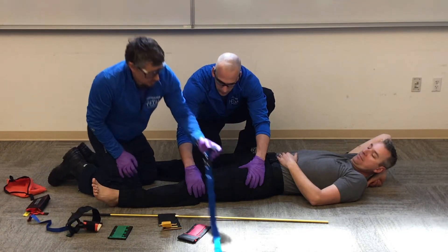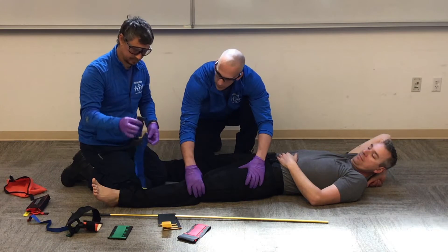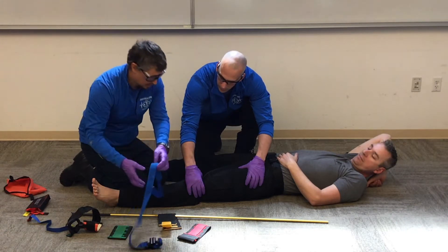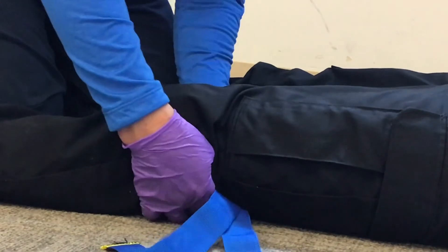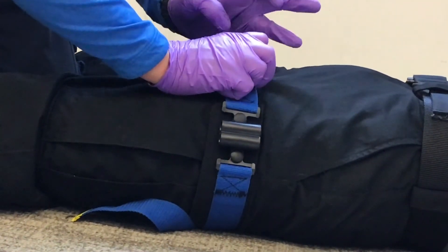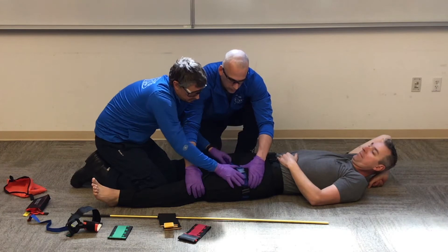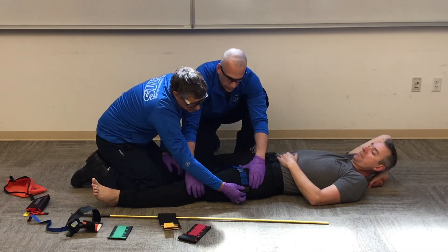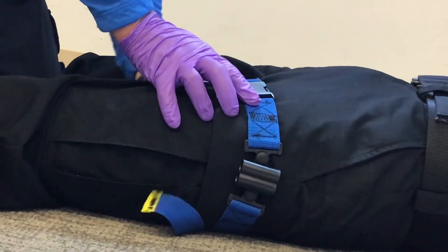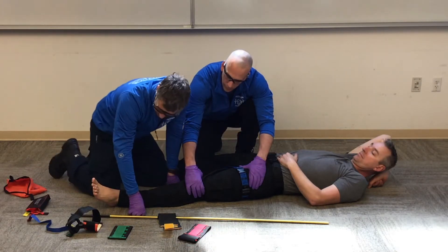To start, we're going to apply our ischial strap. When you apply this, make sure the buckle ends up on top of the leg — if it's underneath the leg you're going to have trouble tightening it down. I'll use the gap in the back of the knee to slide my buckle under and floss that strap high into the groin. Adjust any parts so they don't pinch. We want this double female piece of the ischial strap to be on the side of the leg running right along the bone. We don't need to tighten it too tight because it's the groin that keeps it from moving up.